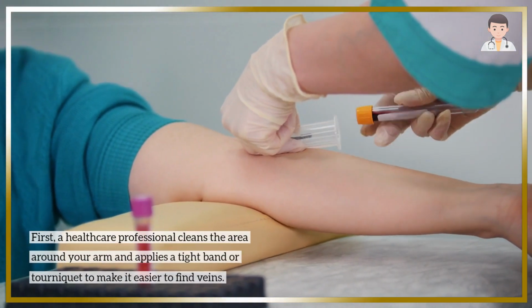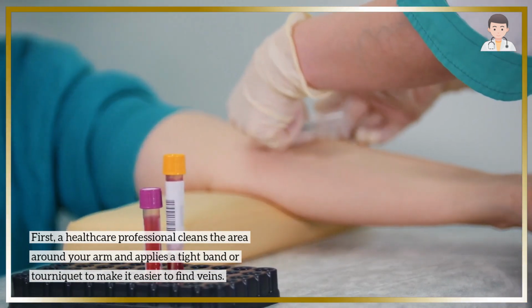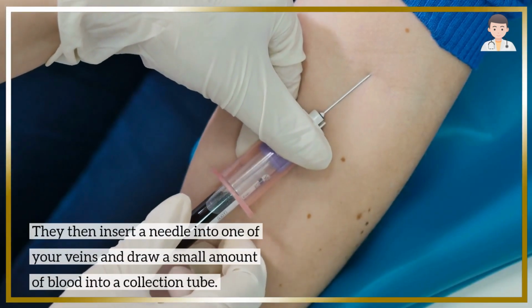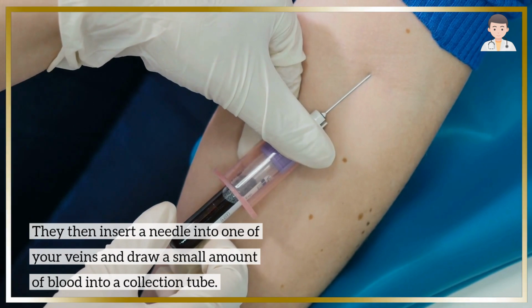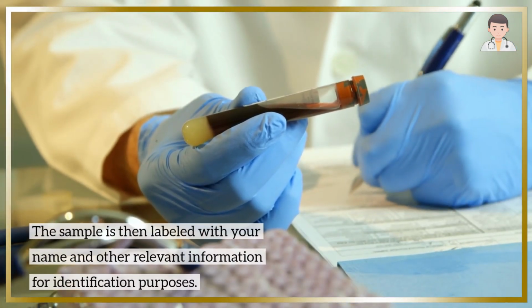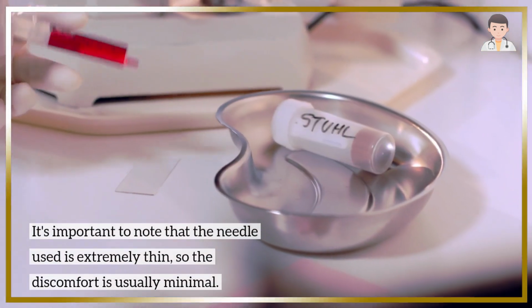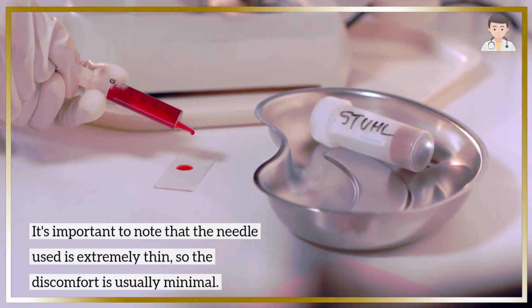First, a healthcare professional cleans the area around your arm and applies a tight band or tourniquet to make it easier to find veins. They then insert a needle into one of your veins and draw a small amount of blood into a collection tube. The sample is then labeled with your name and other relevant information for identification purposes. It's important to note that the needle used is extremely thin, so the discomfort is usually minimal.